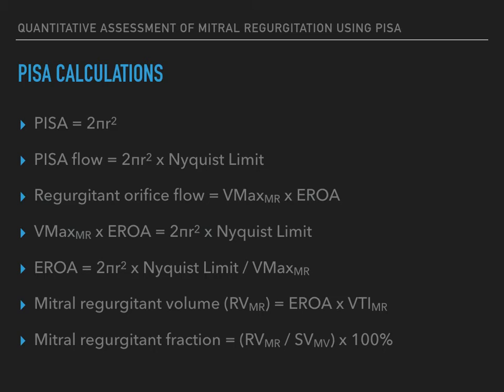Remembering that volume is a product of area and VTI, mitral regurgitant volume can be calculated. MR VTI can be calculated by tracing the MR jet. Multiplying MR VTI by the effective regurgitant orifice area gives the regurgitant volume. Mitral regurgitant fraction is expressed as mitral regurgitant volume divided by mitral stroke volume multiplied by 100%. Mitral stroke volume is calculated by tracing the mitral valve inflow VTI and multiplying that by the mitral valve area.